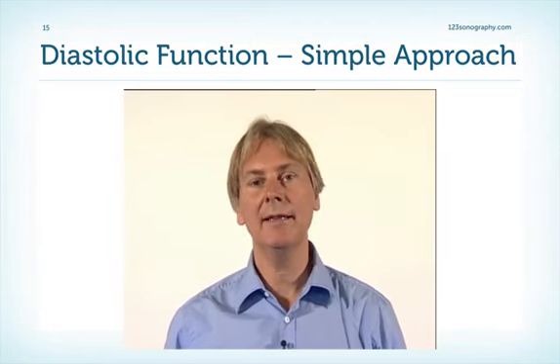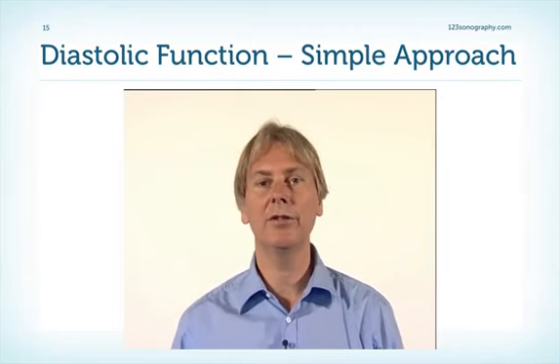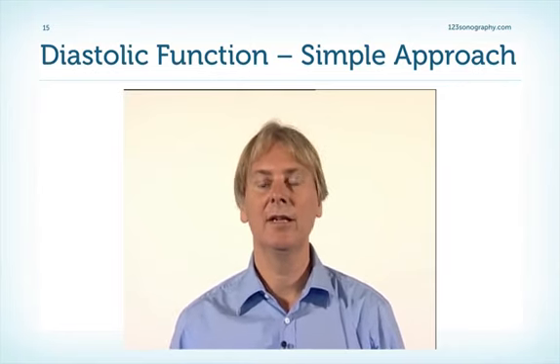But always keep in mind that we have to look at diastolic dysfunction in the context of the whole heart, of all pathologies, and of the clinical situation. Here's another example.